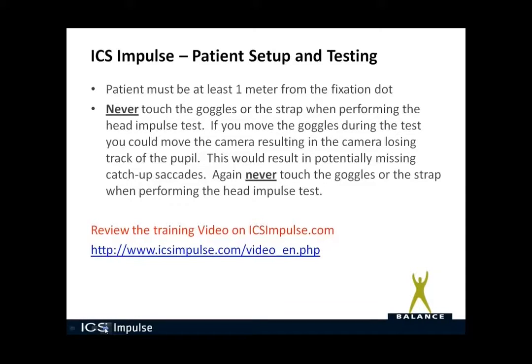So that's why it is recommended that the patient be at least 1 meter away from the fixation dot. You can easily find that answer again on the frequently asked questions as well.